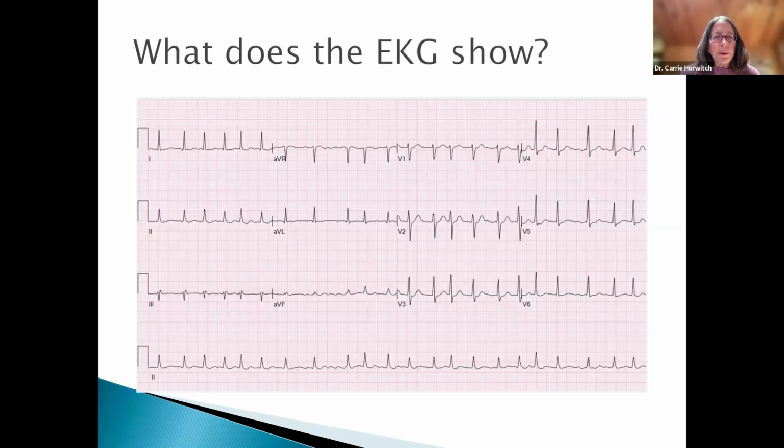So what do people think about this? Again, we've got rate, rhythm, axis, intervals, ST elevations or depression. So is the rate fast or slow?